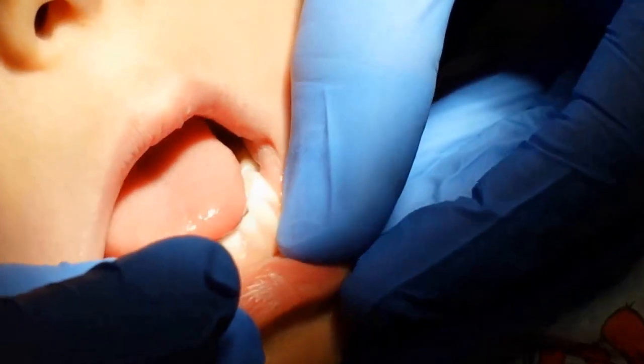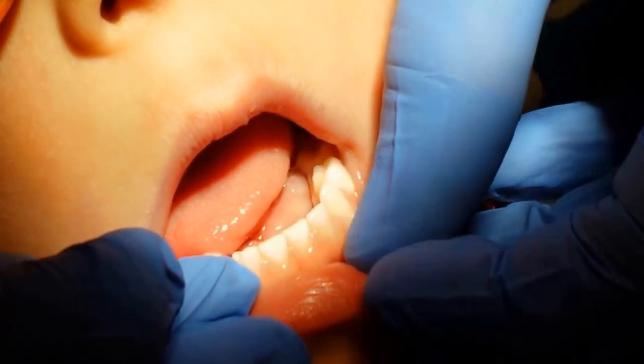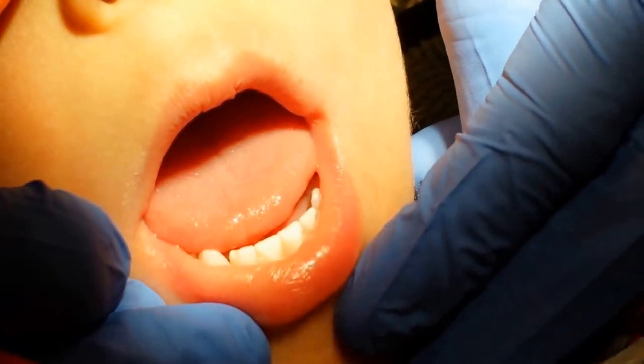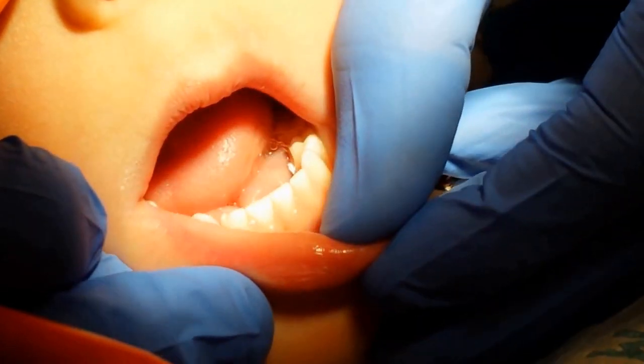Now stick your tongue out at us — way out here. Can you stick it out there? Go ahead and lick your lips. There you go. It's cut. Good job!